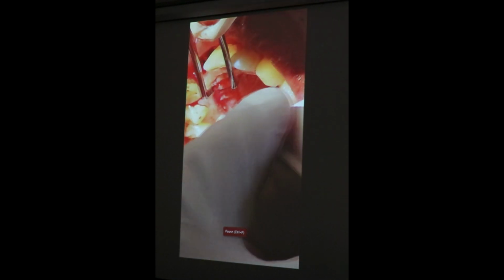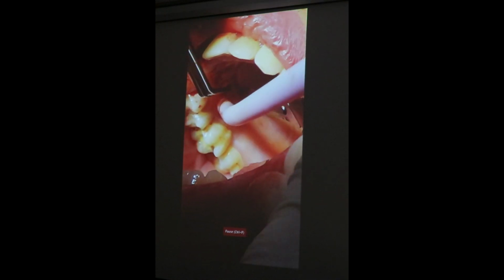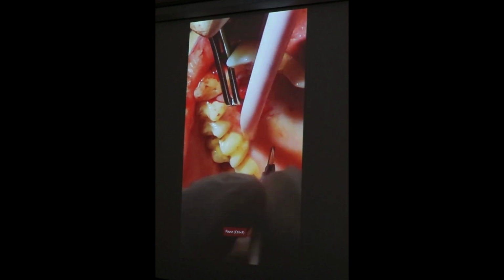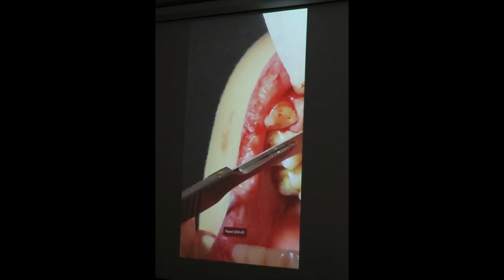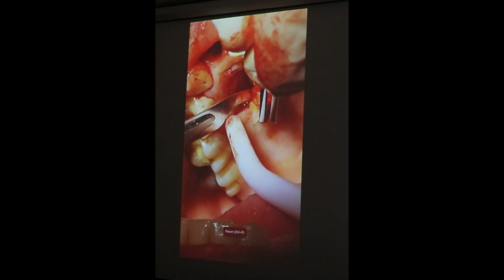But we still have something very important in the 7 points. V shape of the bone. Here there was no bone cuff, no bone circle holding the abutment. There was no tension on the abutment.